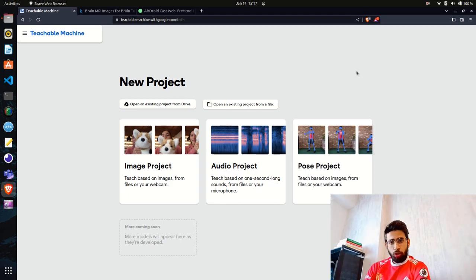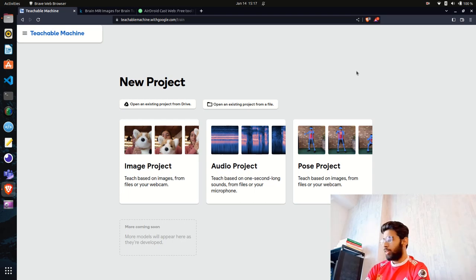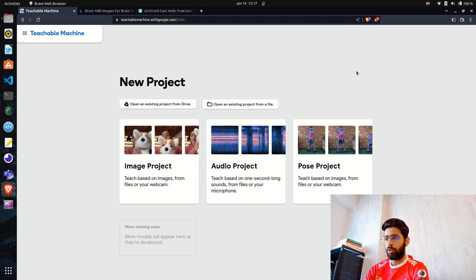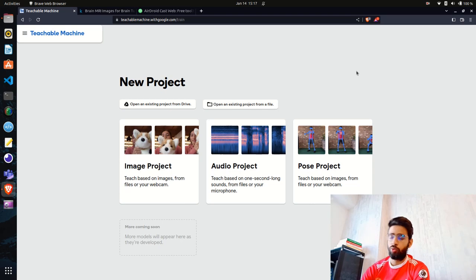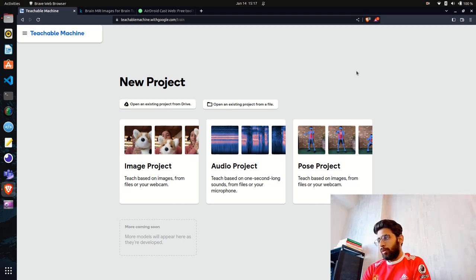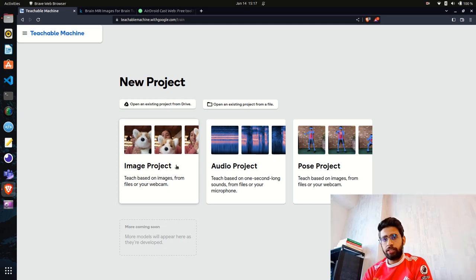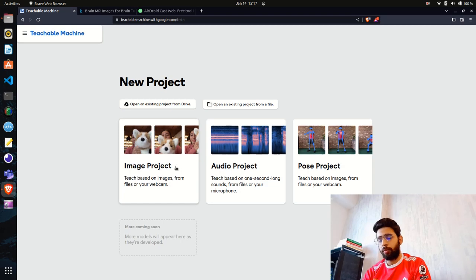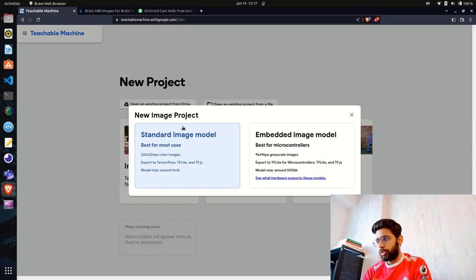Google also has a library called MediaPipe which became very famous for pose classification and has many other features. Teachable Machine works very well for image projects where you can upload your images or create your own dataset directly from the webcam. Click on 'Image Project' and you'll have two different categories.